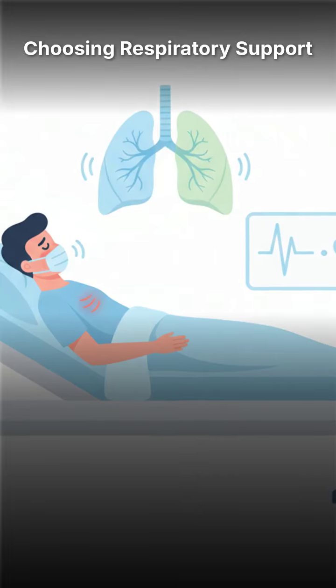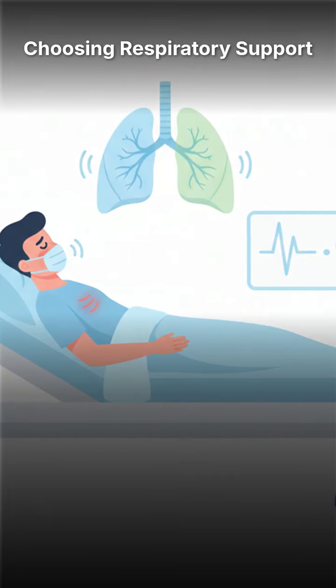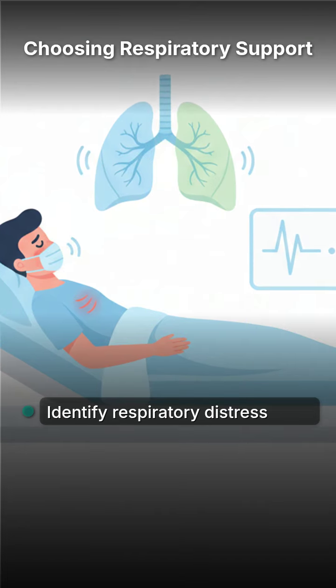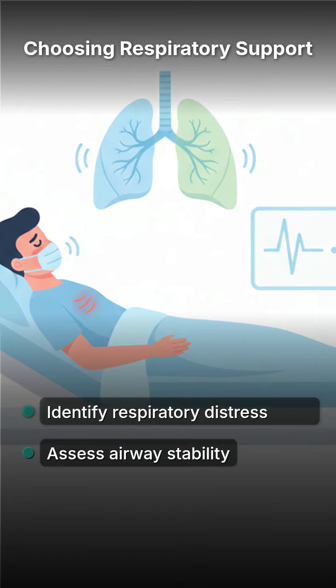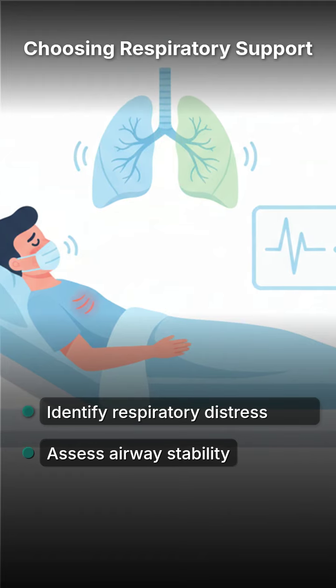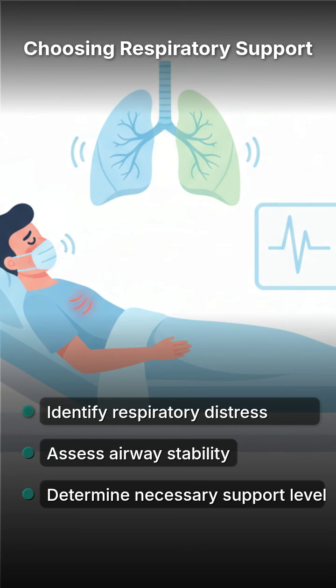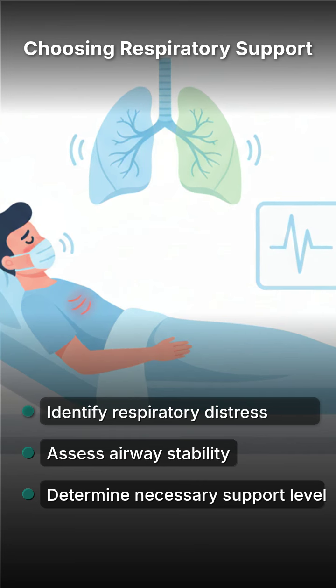Invasive or non-invasive ventilation, what's the difference? Choosing the right support is critical for patients in respiratory distress. We must evaluate the patient's stability and airway protection before deciding. Let's break down these two life-saving respiratory interventions used in the clinical setting.